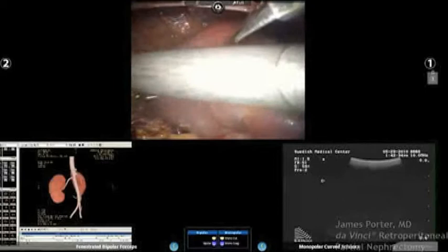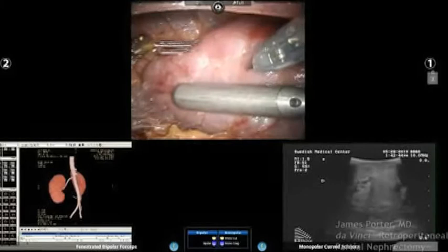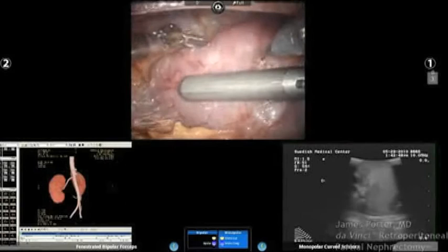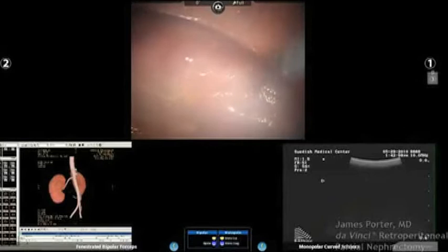So, Lee, any thoughts in performing a robotic partial nephrectomy off clamp with no ischemia time? Look straight down, please. I think it can be done, but only in extreme select cases, the most exophytic lesions, but also based on skill set and experience. But I generally clamp in all of them, except for the ones that are just begging and falling off. What have you guys been doing? Yeah, no, we will routinely clamp.